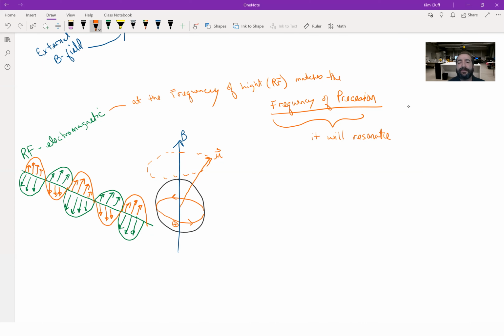But in science, what it means is if two things are happening at the same frequency or same energy level, you'll get some constructive interference pattern, where they will absorb one energy into each other and become stronger. Okay, so this is what resonance is.